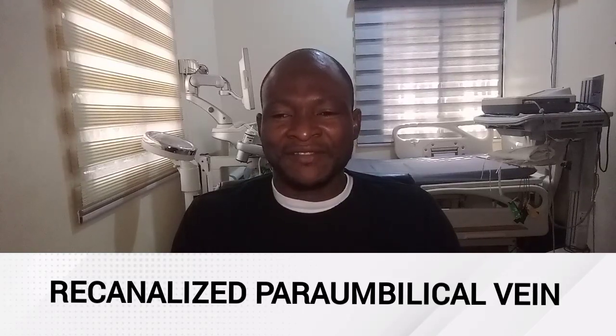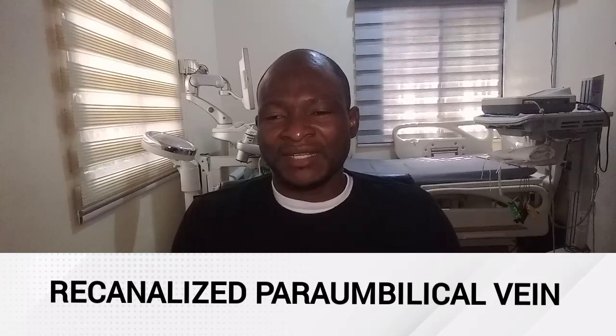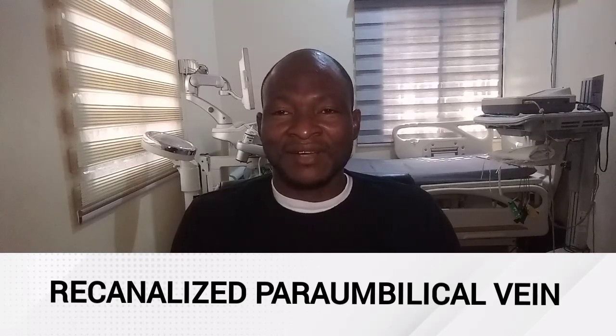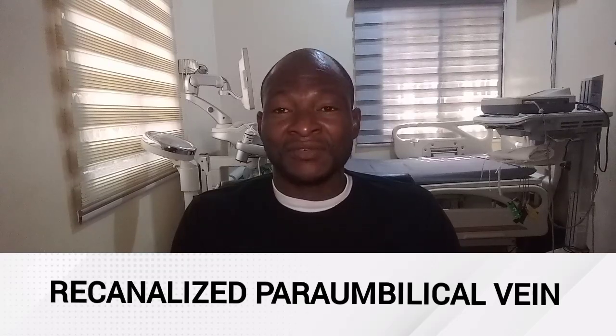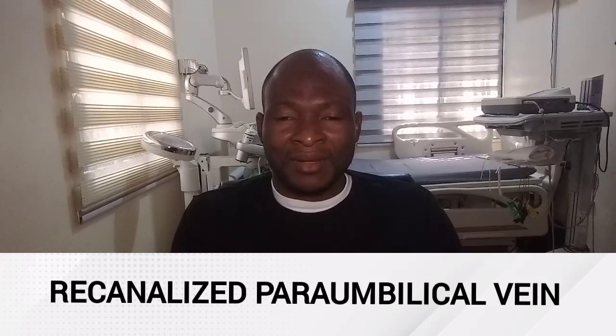Therefore, a paraumbilical vein should be considered diagnostic for portal hypertension only if the diameter of the vein is larger than 3 mm, or if the hepatofugal venous flow has a velocity that is greater than 5 centimeters per second, so that you will be able to differentiate what is a normal variation from what is actually a pathology.